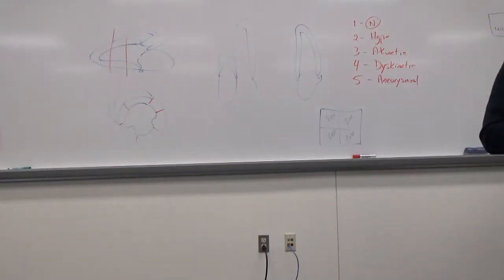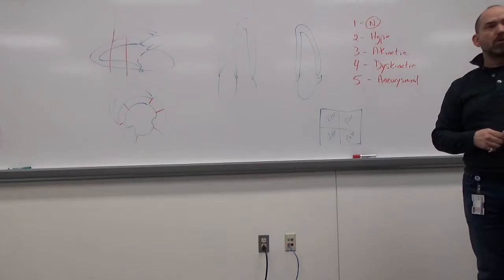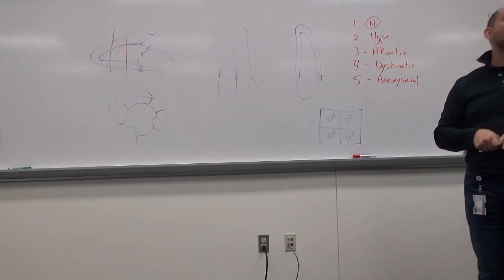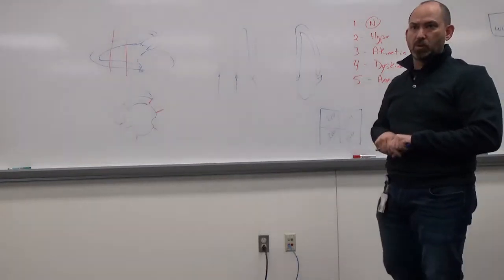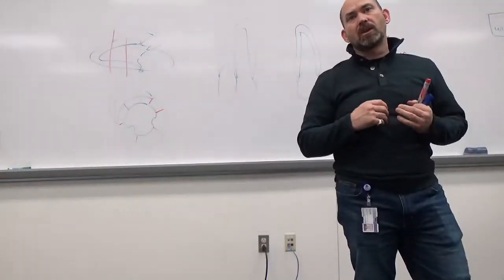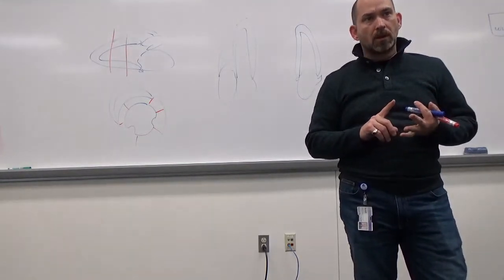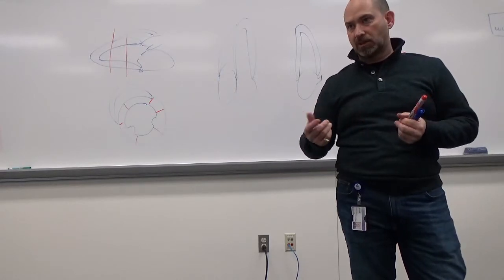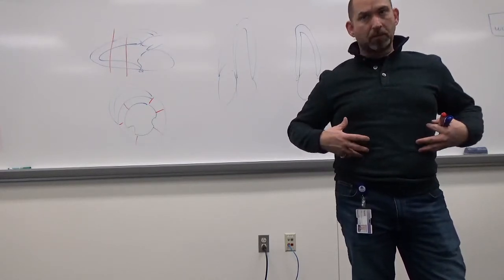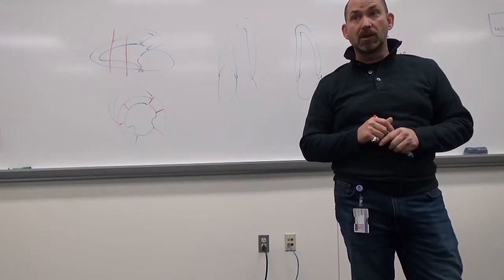Having said that, we also use contrast agents to be able to enhance our echo wall detection. So we'll use echo enhancing agents, which is what they prefer us to call them now, but contrast can be used as well. The reason we don't like to say contrast is because what do you think of when you think of contrast? We think of angiograms, we think of things that wreck kidneys, and patients think the same thing. Some of them may have had a bad experience with that, and they may have reacted to it. That can cause some kidney damage.